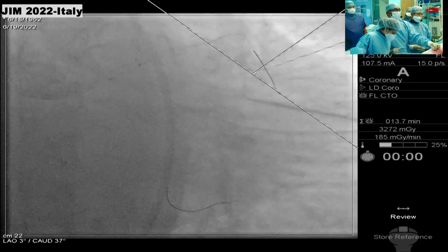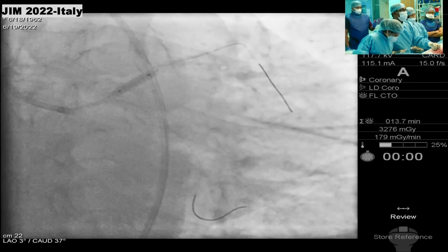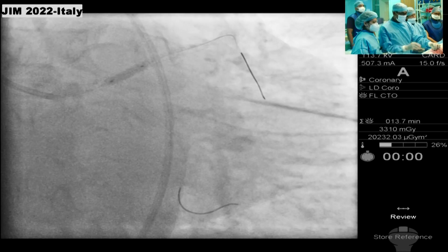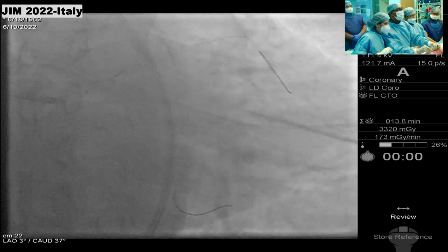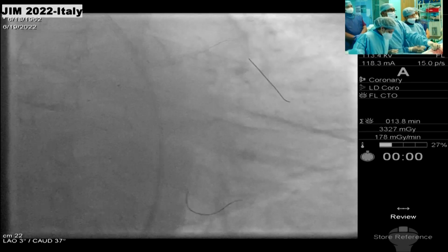So I would say we have so much done about OCT. Everything's going so smoothly, by the way. You are able to complete everything so quickly. Let's just do the OCT and we have time. Yes, we'll do the final OCT run after this post dilatation. You do OCT to both directions.